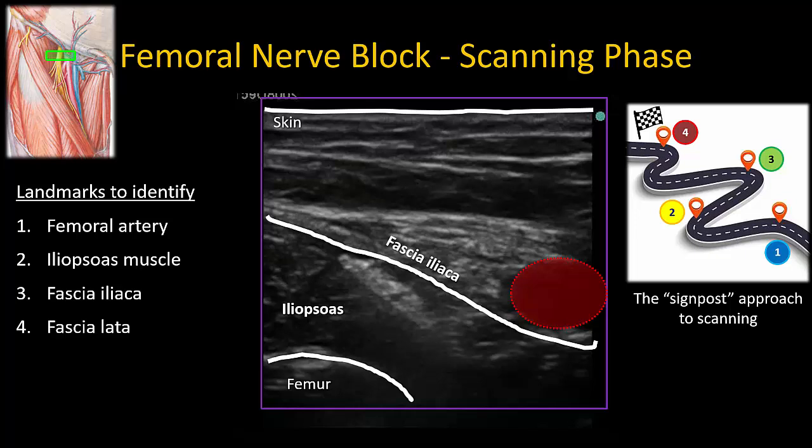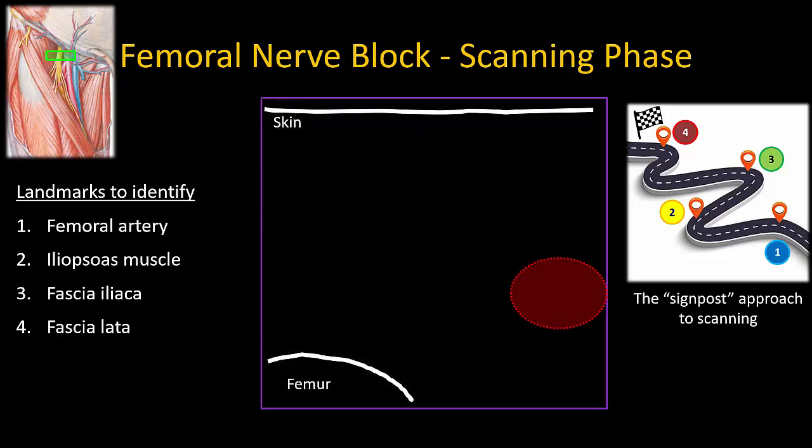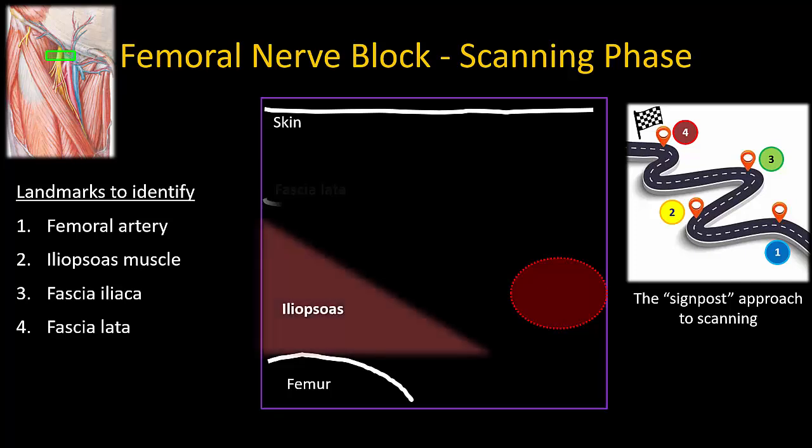The fascia latae, by contrast, runs medially over or superficial to the femoral artery. The femoral nerve always lies deep to the fascia iliaca, which splits to encase the nerve in its own fascial compartment where it rests on the iliopsoas muscle. It is critical to recognize these fascial layers so that the hyperechoic area immediately adjacent to the femoral artery is never mistaken for the femoral nerve. With practice, pattern recognition will become second nature.